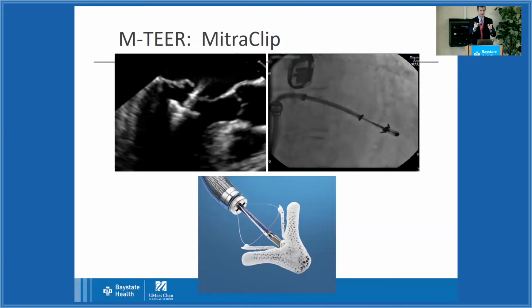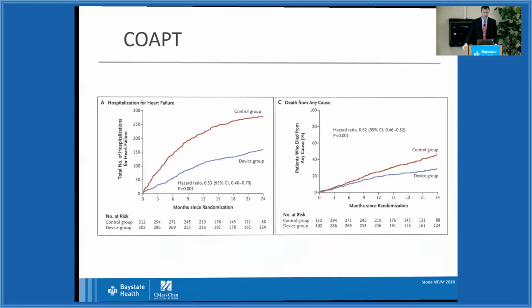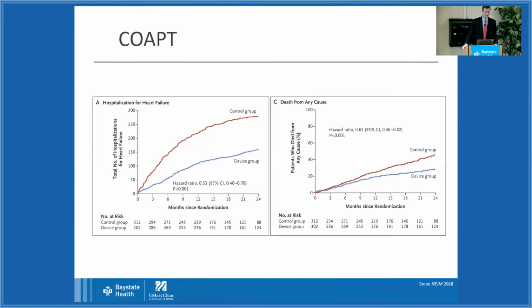I know what you're thinking. Andy, does this really work? It's a theme, right? So it does, it turns out. And then here are the data. The trial was called COAPT, and COAPT enrolled 614 people, and essentially compared them, half of them getting the device, having their valve repaired, versus having just maximum medications. And they followed them for 2 years.